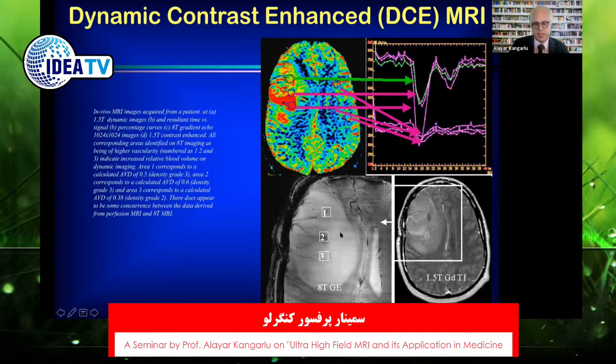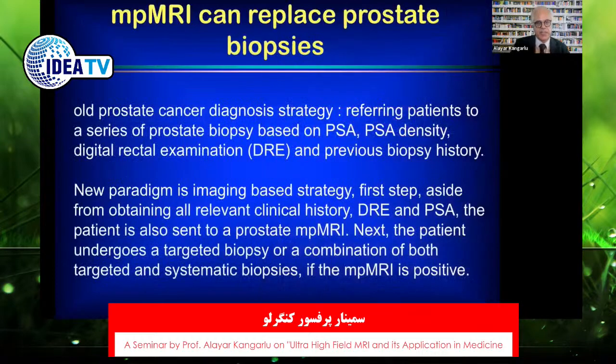Now, at the bottom, you can see MRI of the same patient. The 3 regions of the tumor, you can see that without even contrast injection, the susceptibility represents an inherent classification between these 3 brain regions, which tells us that if you compare the 1.5 Tesla image on the right compared to the 8 Tesla image on the left, the microvasculature environmental details within the tumor, whose boundary is shown here with the brightness characteristic of these tumors, is really a telltale sign of how susceptibility can help us even in the areas that we couldn't imagine.